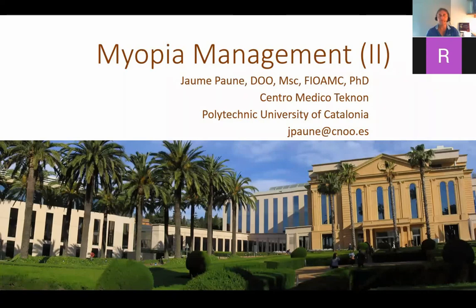One of the problems with soft or GP lenses is that they could choose not to wear the lenses if they don't want to. That's the problem. They could say, today I have gym, I will not put my lenses on. So that's one of the problems we have with lenses that are used during the day, and that could be one of the reasons these lenses are less effective.